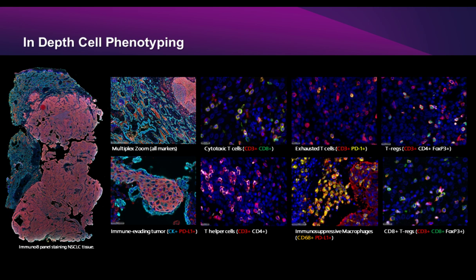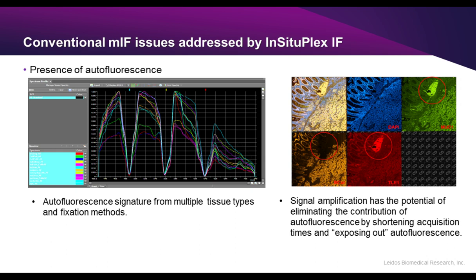Yeah, and I concur. With Katir, I think if we looked at that one slide that I had with the representation for the autofluorescence, what we see is that with these amplification technologies, the signal can generally overcome a lot of autofluorescence that's present in the sample, and you're going to still have issues with folds and all those kinds of things, with artifacts of sample handling and sectioning.